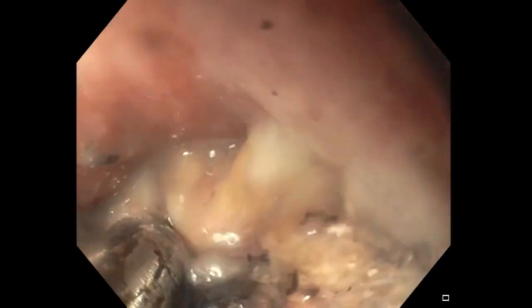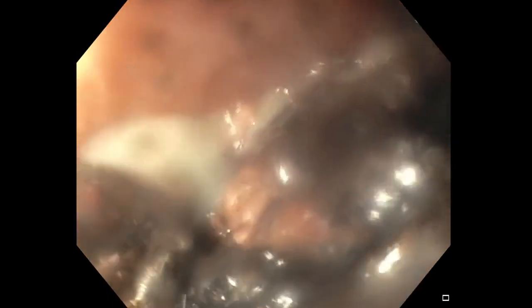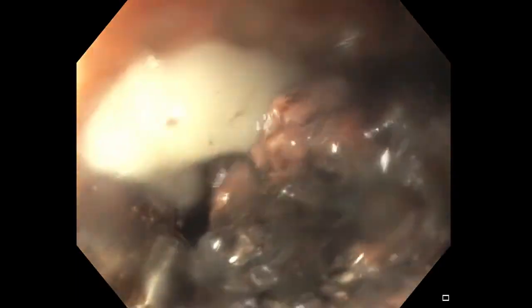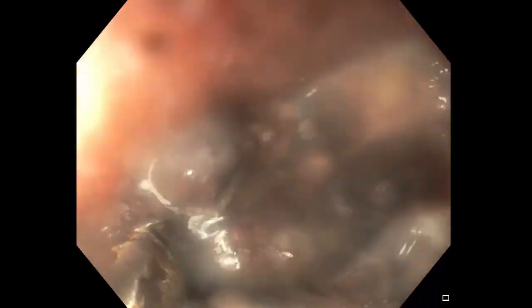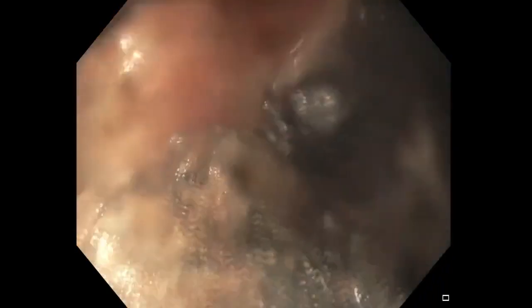You can dig the tip more deeply into the necrosis. What we look for is the necrosis spinning around, indicating that it is being suctioned in. Here you can see a large amount of pus after we have opened up a pocket of necrosis.